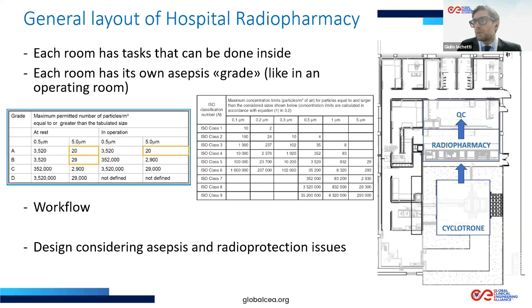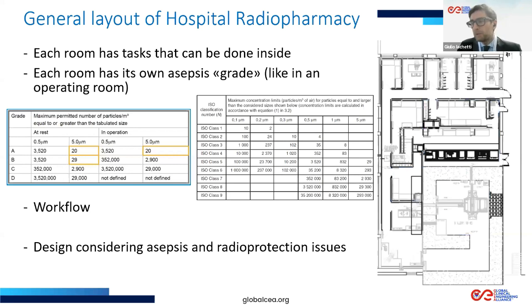Then typically you have to make the quality check, and after the quality check you can deliver. And delivering, you just make the availability of the dose for the final patient. Okay, just another point on this slide.